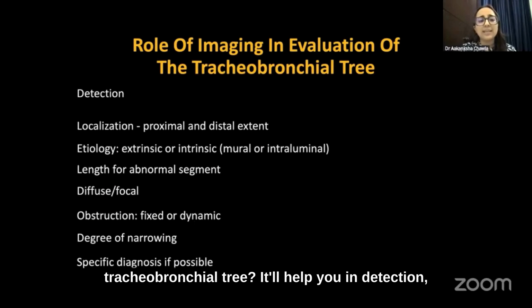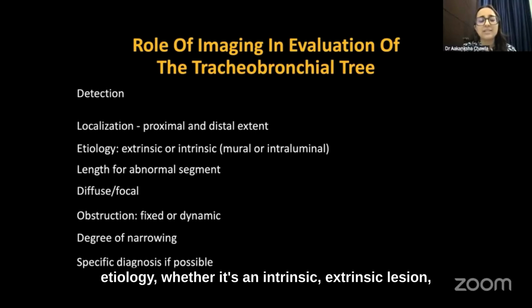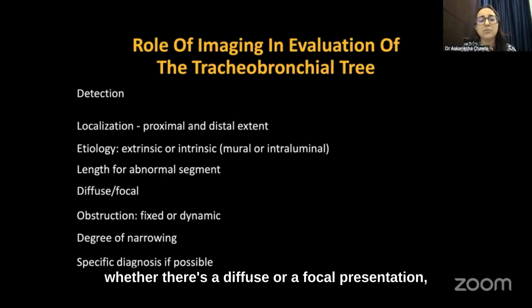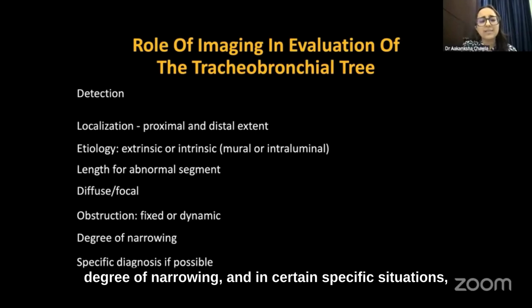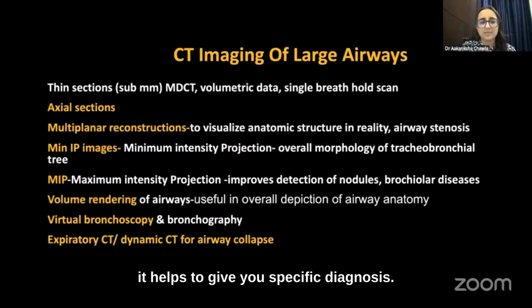It will help you in detection, localization of where your lesion is, etiology, whether it's an intrinsic or extrinsic lesion, what is the length of the abnormal segment, whether there's a diffuse or a focal presentation, whether there is any obstruction, degree of narrowing, and in certain specific situations, it helps to give you a specific diagnosis.